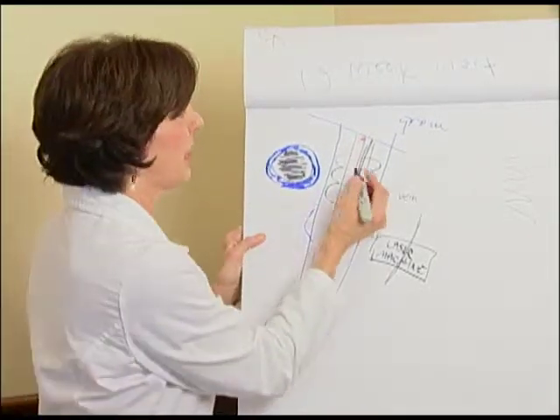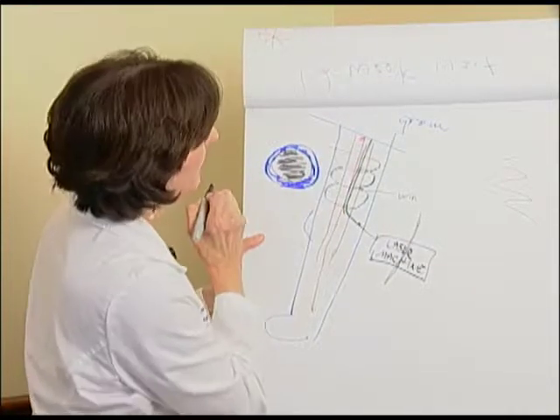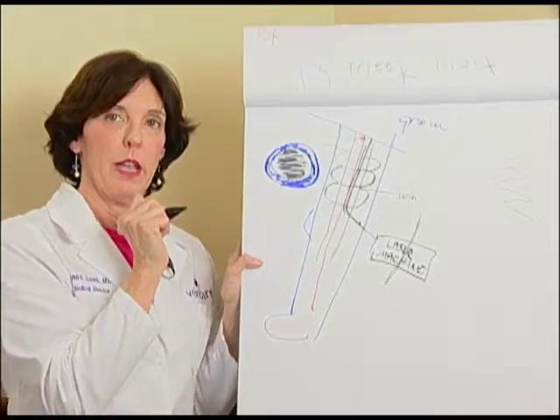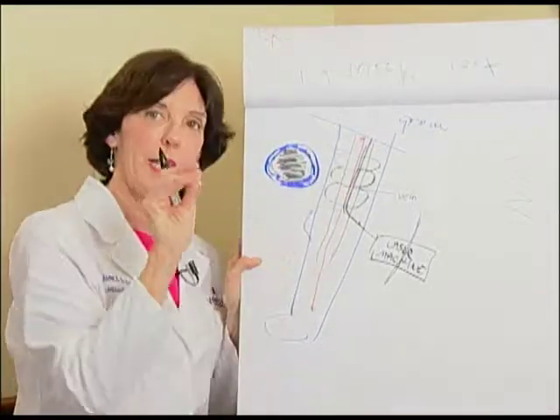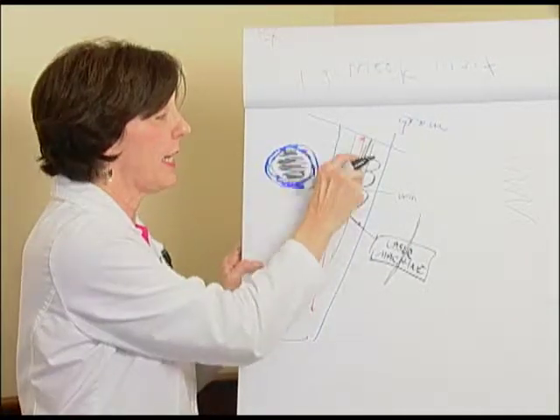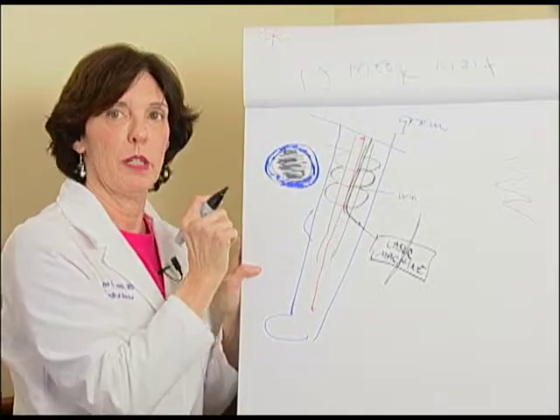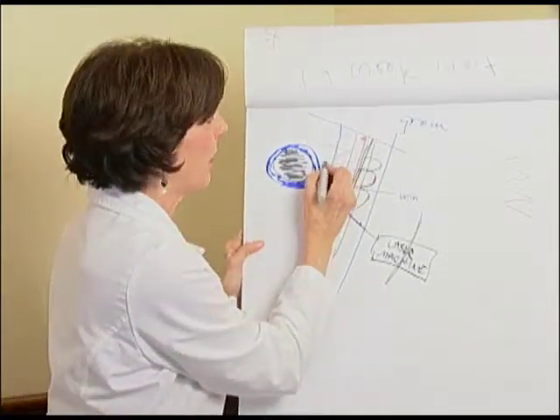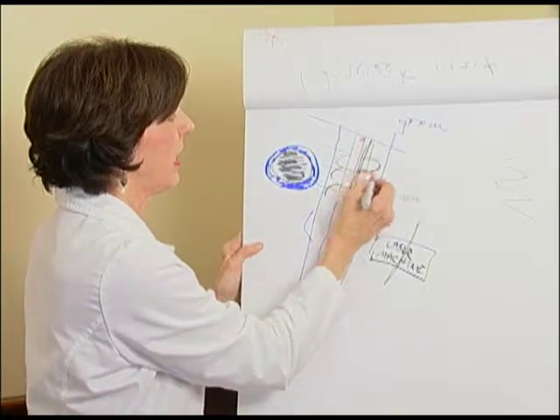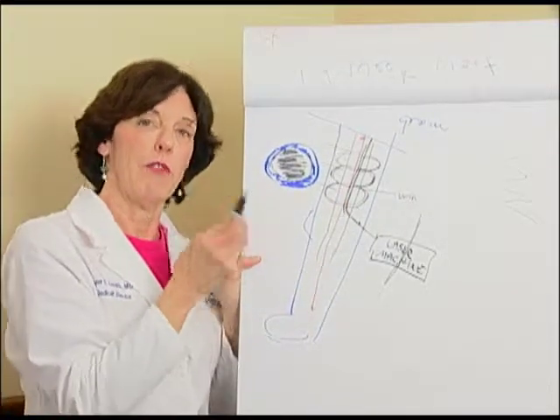So what we do is a series of injections. Now again, this is essentially exactly the size of the needle. I always say that it's the size of a needle, the smallest one you use to turn up a hem. So it's teeny, but a needle's a needle, so I'm not going to lie to you. You do feel the poke, but it's not horrible. But we do a series of injections, and our goal is to have lots of fluid around that vein. Now the fluid is essentially IV fluid.